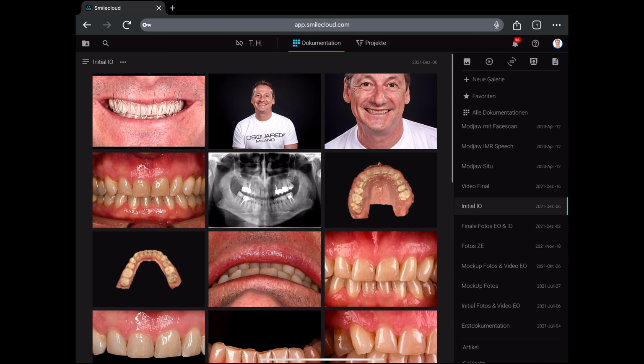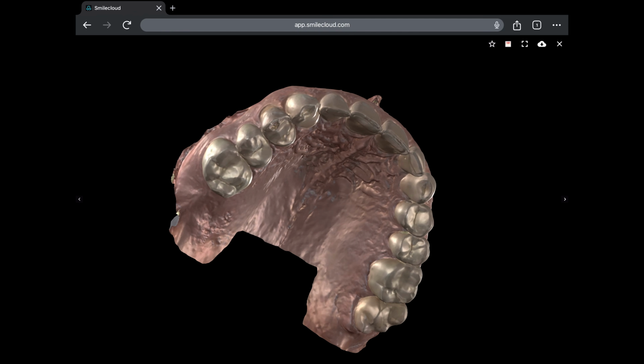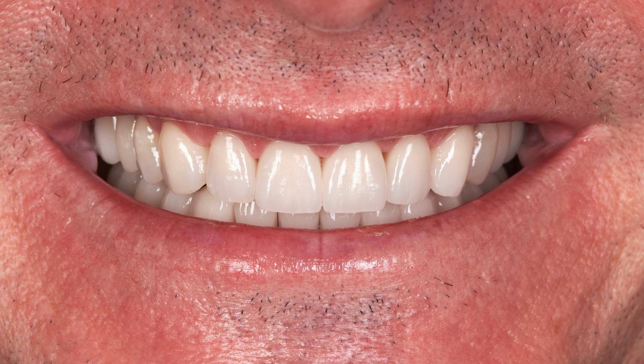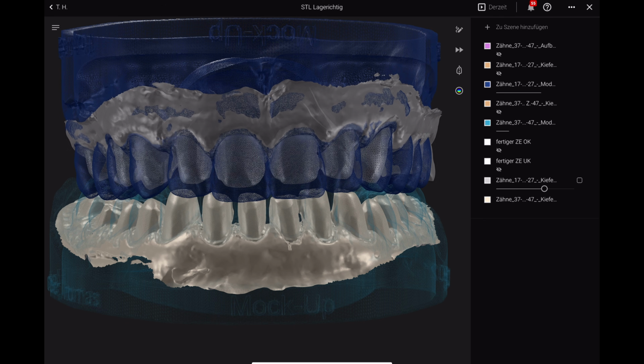This technology allows us to follow the patient journey throughout their entire therapy, making sure that we can superimpose different files throughout the treatment, and we and our patients get exactly what we are planning and agree on with outstanding results. Avatars really change the landscape of dentistry by guaranteeing that no detail gets forgotten or overlooked. They ensure that everyone involved in the therapeutic process, patient, technician and dentist, is on the same page.